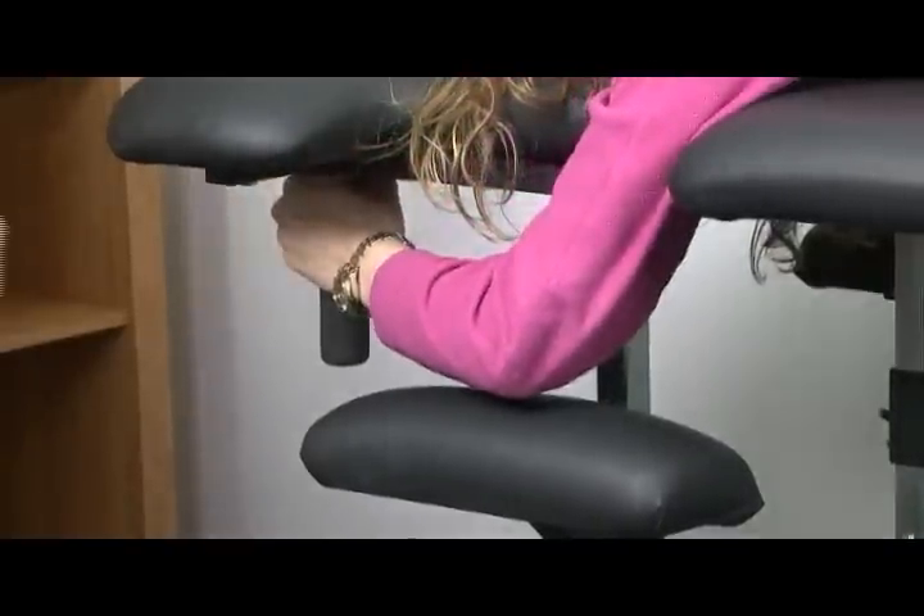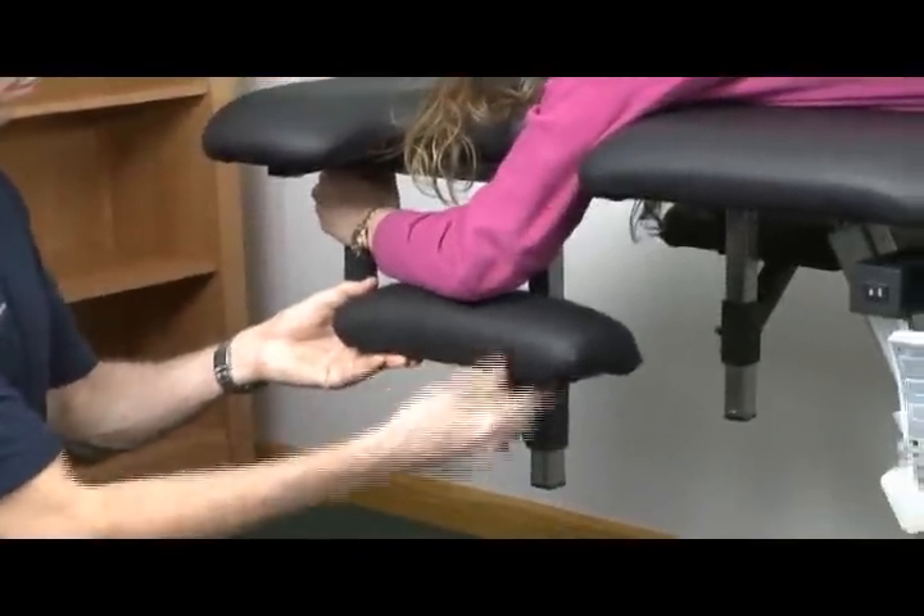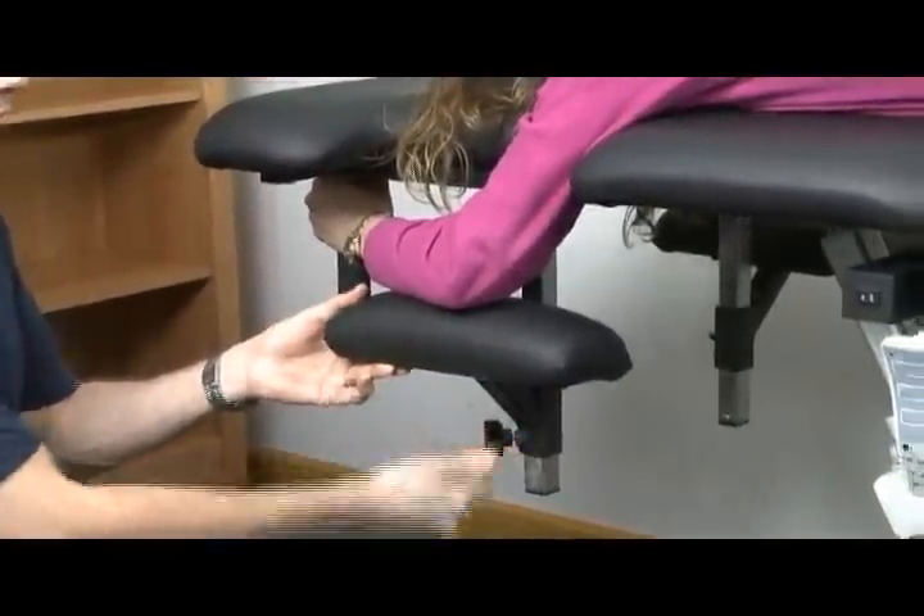Most patients will not require additional thoracic restraint in the prone position. Simply adjust the armrest to the proper height and instruct the patient to hold on to the grab bars as shown. This allows comfort to the scapula and detensioning of the latissimus dorsi. The patient's triceps are comfortably buttressed against the padded caudal surface, providing additional thoracic restraint without the breathing difficulty or abdominal compression some patients experience with a wing vest.